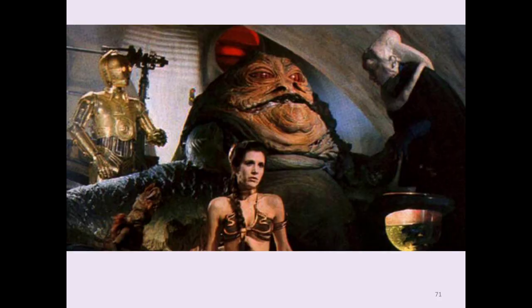Remember, we'll do a formal airway assessment. We're really trying to encourage an out loud formal airway assessment and talk about why each of these people are going to be difficult to intubate. So remember, we're teaching LEMON, which will help you maybe predict the difference between an anticipated difficult airway, which is every ED airway, to an anticipated very difficult airway, where maybe RSI won't be appropriate in some situations.